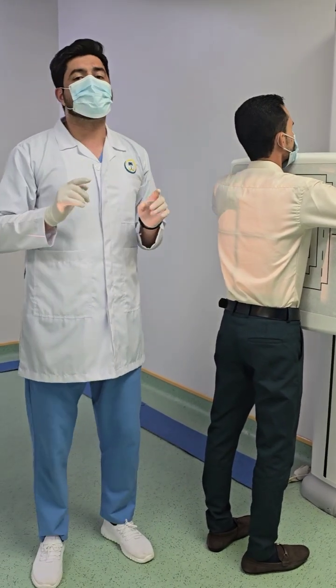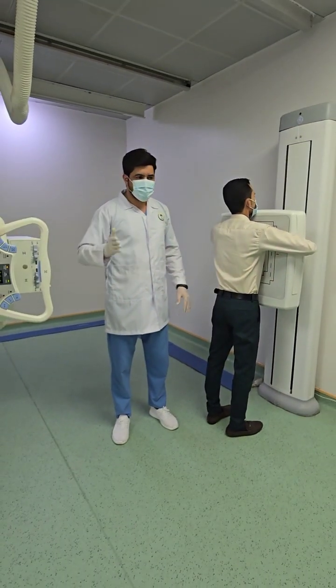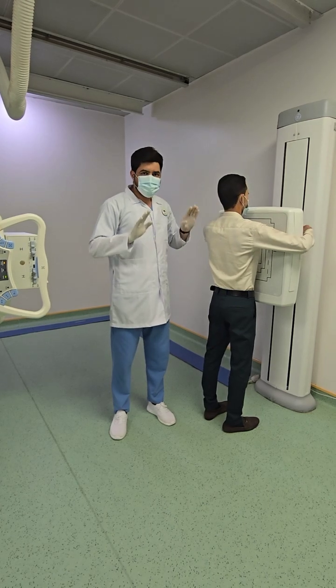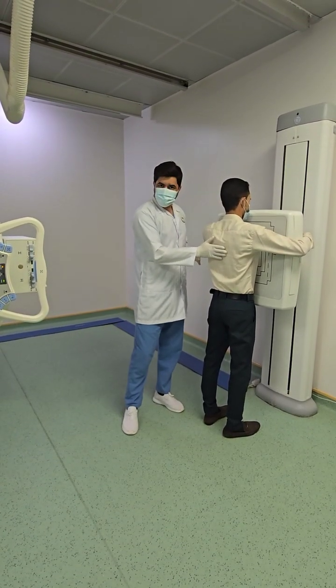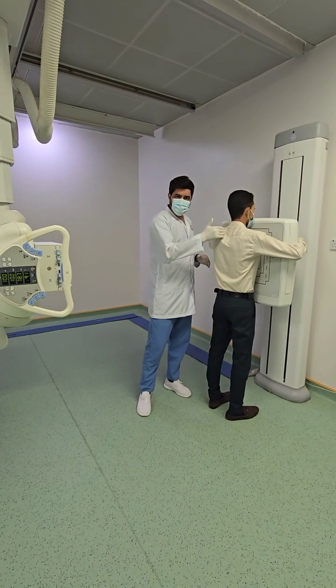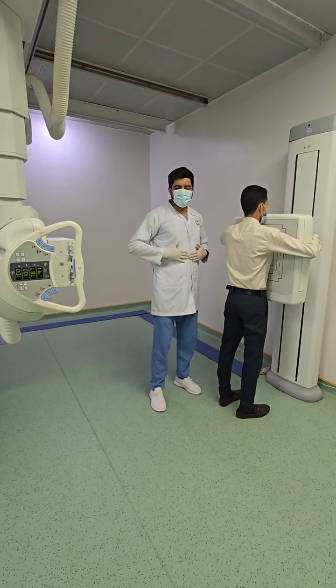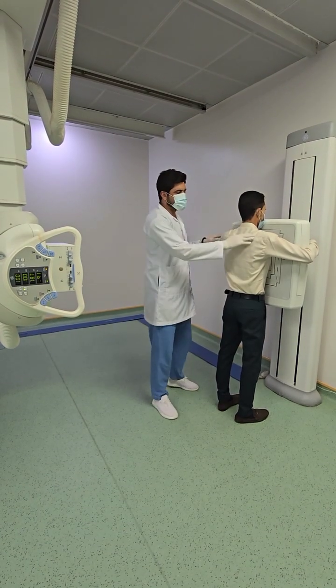Keep one thing in mind: in the posterior anterior, first we will consider the X-ray tube, but in the oblique position we will consider the detector. So in the posterior anterior, the X-ray will come, interact with the posterior aspect of the body, get into the body, and emerge from the anterior aspect of the body, and finally it will interact with the detector. Okay, this is the posterior anterior.